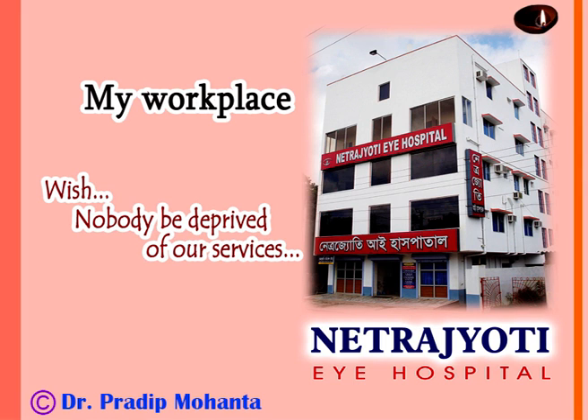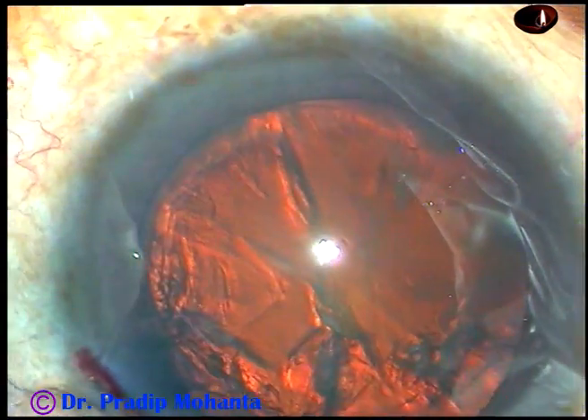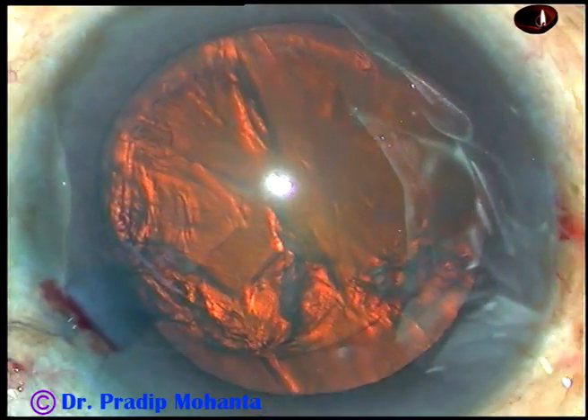Friends, welcome to my workplace at Rana Ghat, West Bengal, India. In this video, I want to show very slowly the lens tilt technique of soft nucleus management.